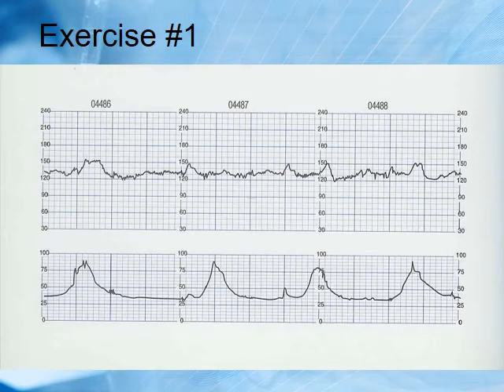Okay, so let's give a physician report on this tracing, starting with the contractions. How often is she contracting? How long are they lasting? And I don't know if we'll say it's an external, so I won't ask you about intensity. So how often is she contracting?